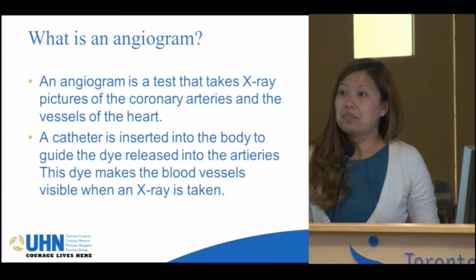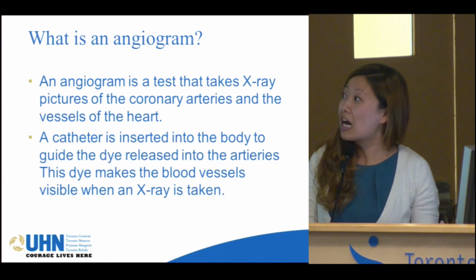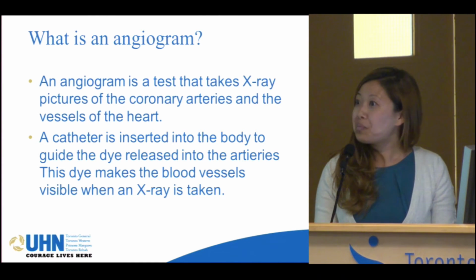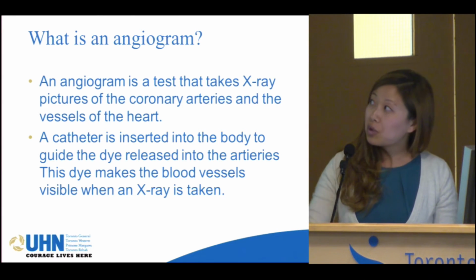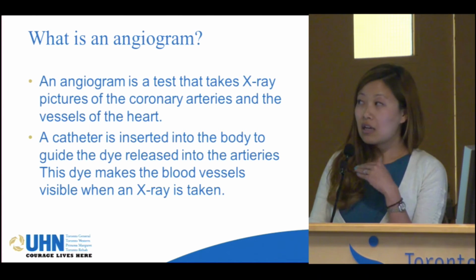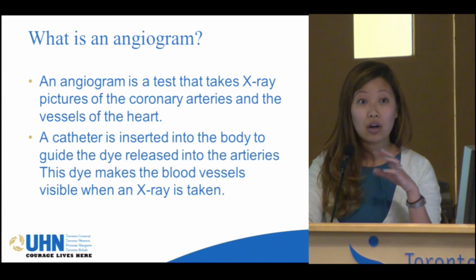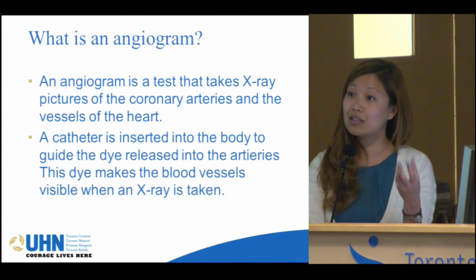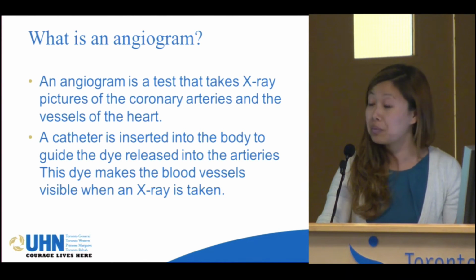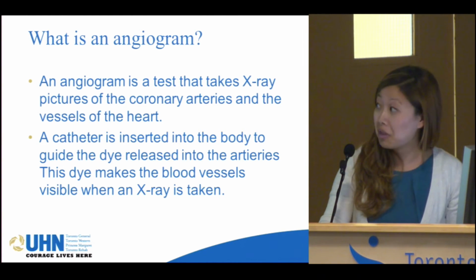So what is an angiogram? I don't know if you guys remember this traumatizing event, those of you who've had it, but most people do not forget this test. Short story is basically we're taking an x-ray of the coronary arteries. But just like any muscle, if we were to take an x-ray, we can't actually see what's going on in that individual muscle. So we have to highlight that coronary artery and then take the x-ray that way, so we can see the full picture. Check if there are any blockages or any narrowing, and then we decide what we're going to do from there.